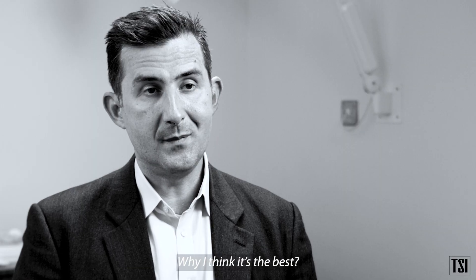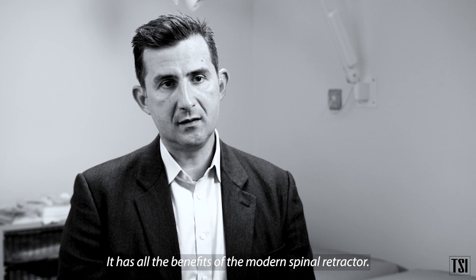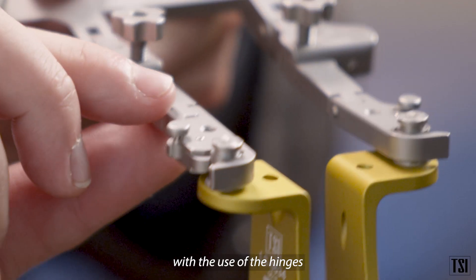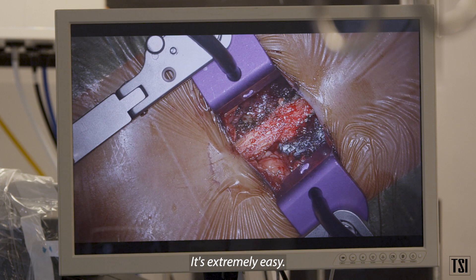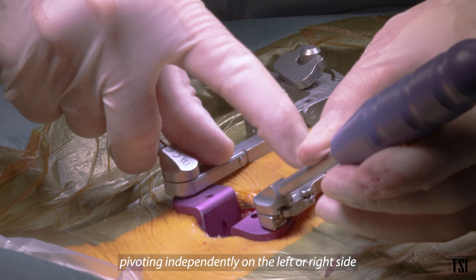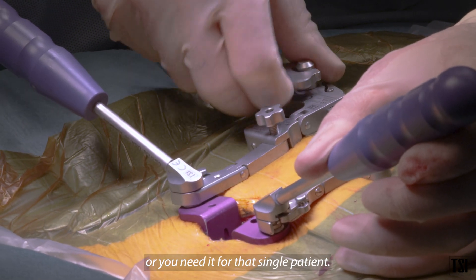Why I think the Hank 10 is the best: it has all the benefits of the modern spinal retractor. The retractor is designed so that it can conform, with the use of hinges, to the external and internal human anatomy. It's extremely easy, and it allows you to change the pivoting independently on the left or right side according to normal anatomy or as needed for each individual patient.